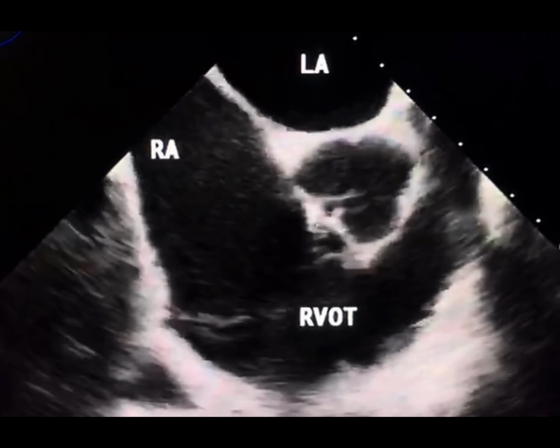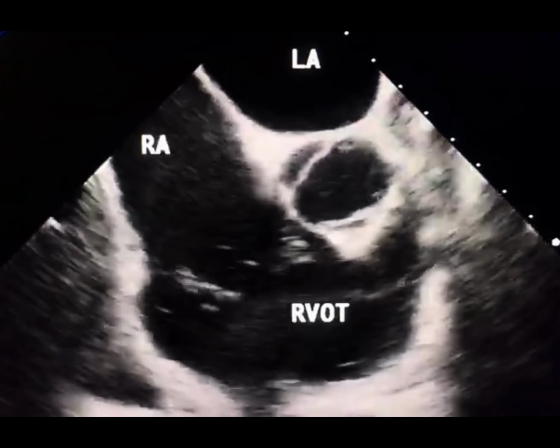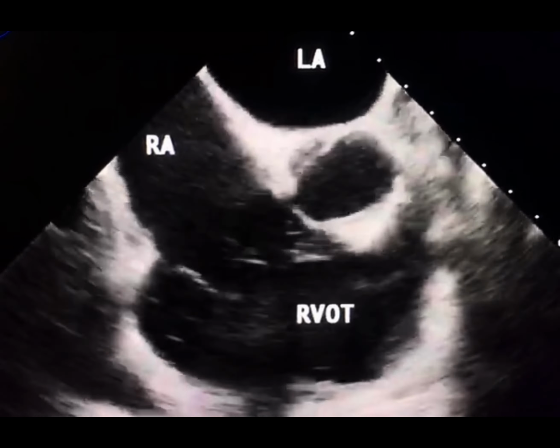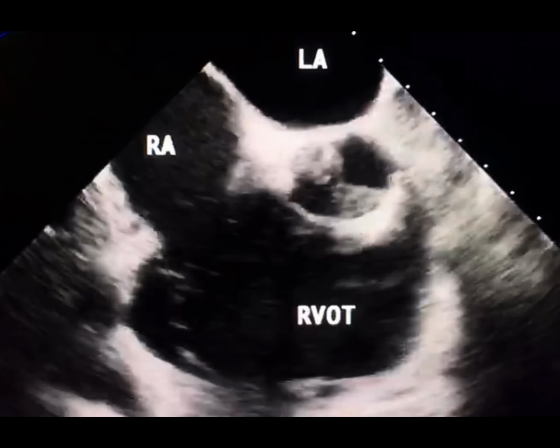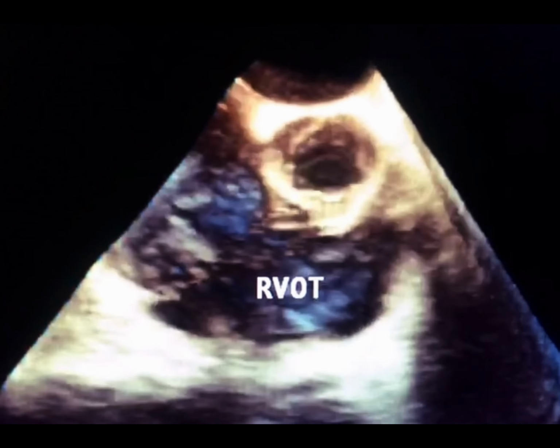In this view, the right ventricular outflow tract, RVOT, is dilated and severely dysfunctional, with areas of thinning. This is a case of arrhythmogenic right ventricular dysplasia, ARVD. And this 3D confirms the findings.